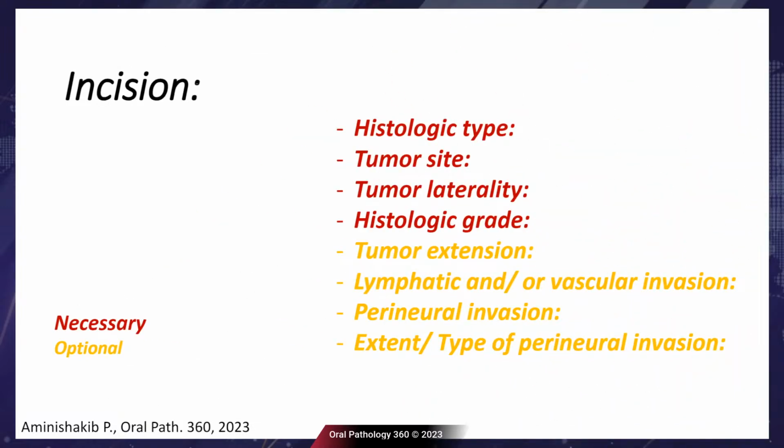But when you have an incisional biopsy, it is necessary to report histologic type, tumor site, tumor laterality, and histologic grade. But I recommend you search and review the microscopic slides for tumor extension, lymphatic or vascular invasion, perineural invasion, and type of perineural invasion, to clarify the situation and the extension of the tumor for the surgeon to plan the treatment and therapeutic approach.